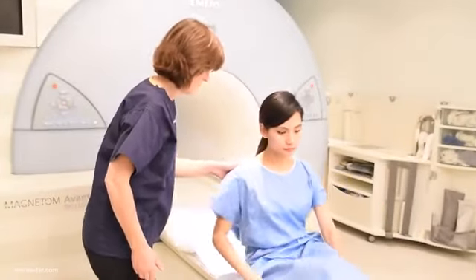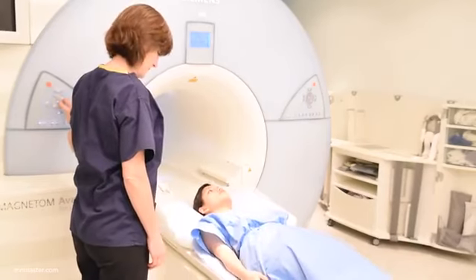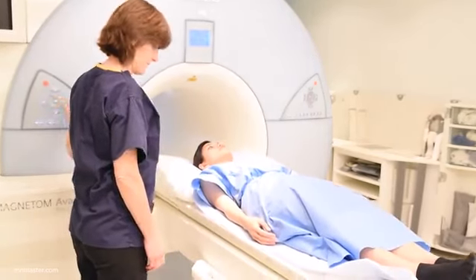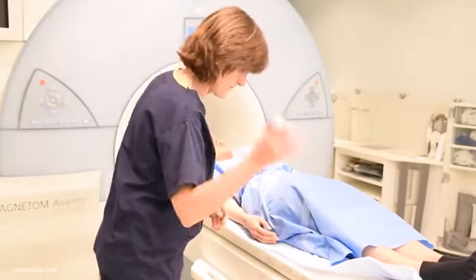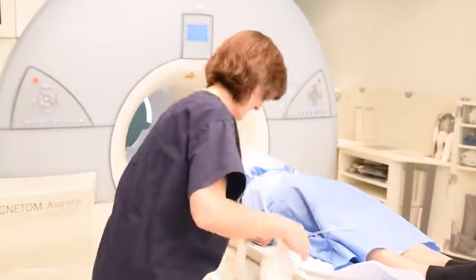After the safety checks have been performed, position the patient supine on the scanner table with their head on a pillow. Give the patient an emergency buzzer and provide headphones to protect the patient's ears.